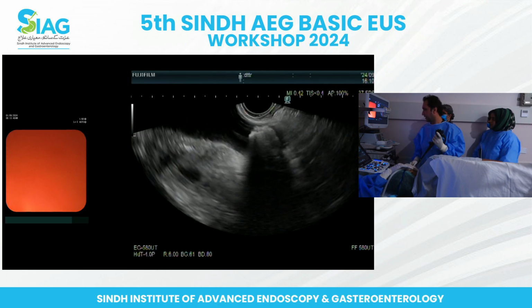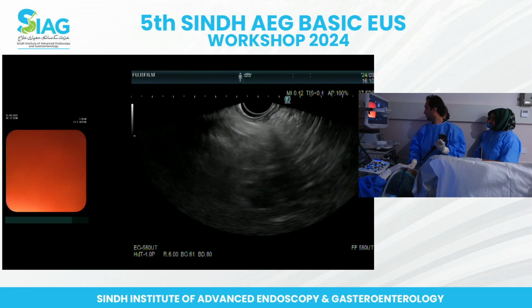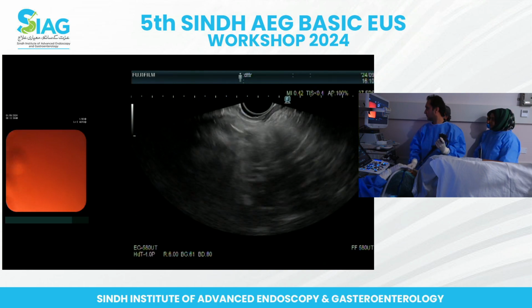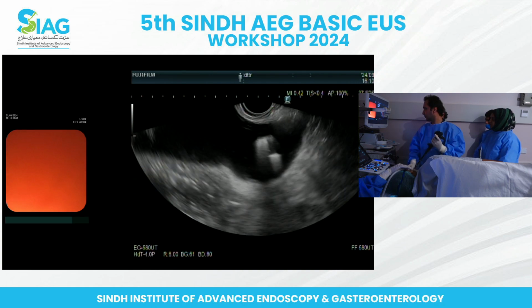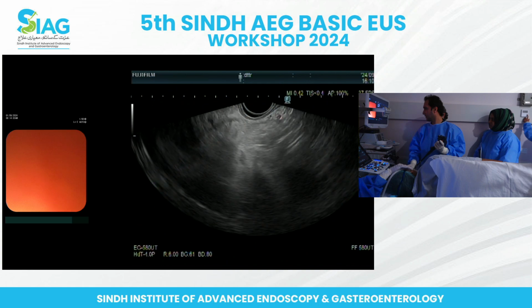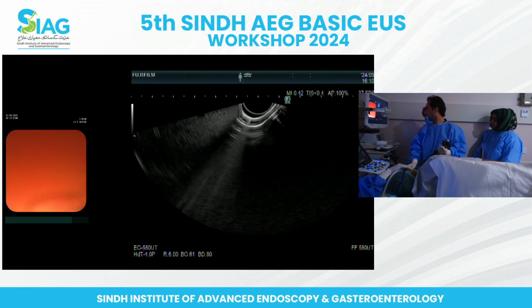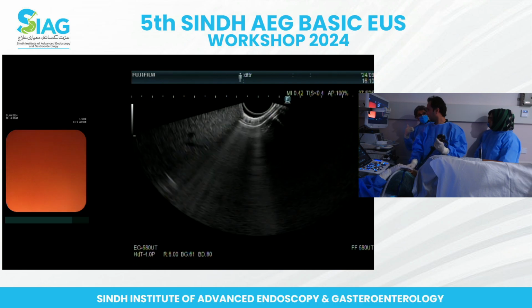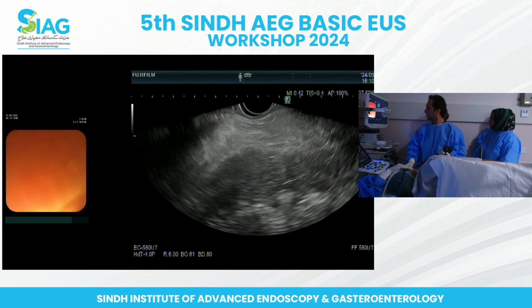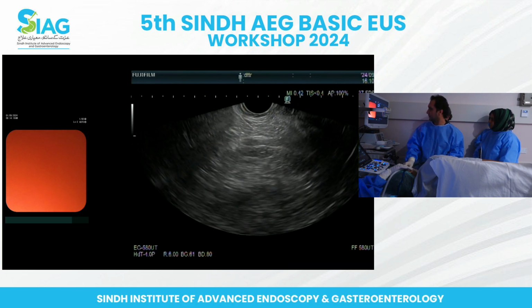That's a gallbladder. Can everyone see the stone? A large stone there. But no gallbladder wall thickening, so that's good. There's certainly some sludge. 2 stones. So it's not really uncommon. I'll always come back and re-intubate the D1. Honestly, it's not uncommon to do this, and that's absolutely fine.